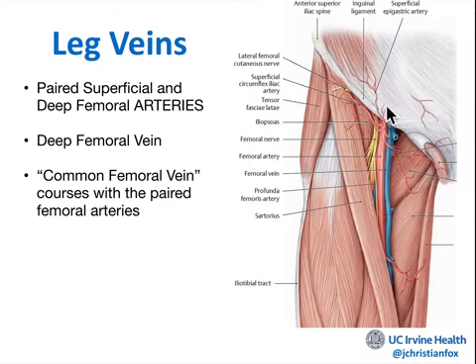So venous, penis, that's how I can remember that orientation. I know there are more professional ways to think of that, but in the heat of the battle, that is always something that I can remember. Because sometimes you're upside down, trying to put a catheter in this vein, and you're looking at the machine the wrong way and everything's getting confusing, but that always grounds me. You could also say venous vagina if you'd like.